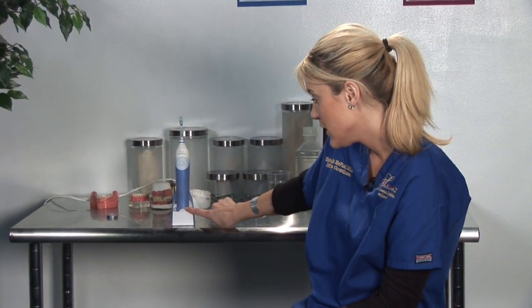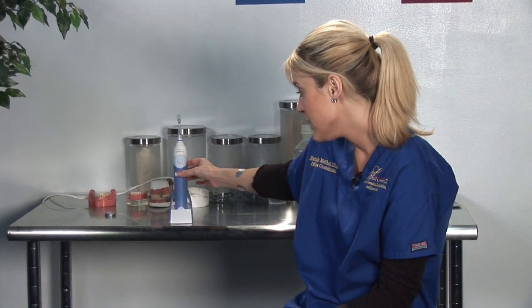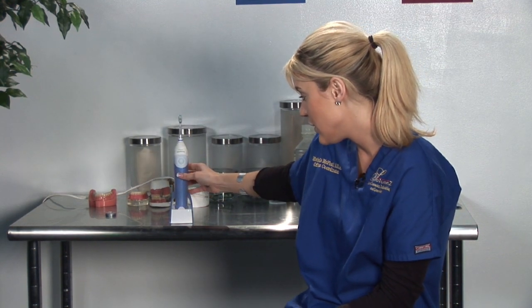You can tell by the green light at the bottom that it's actually charging. This is a sensor charger, so when it's off the charger it's not lit, and when you put it on, that's when it lights up — that's how you know it's charging. My name is Michelle, I'm a dental assistant with Solutions, and I just explained how a Sonicare toothbrush works.